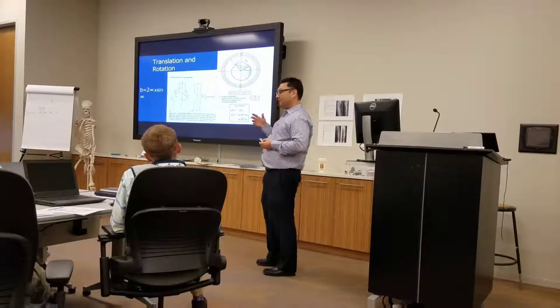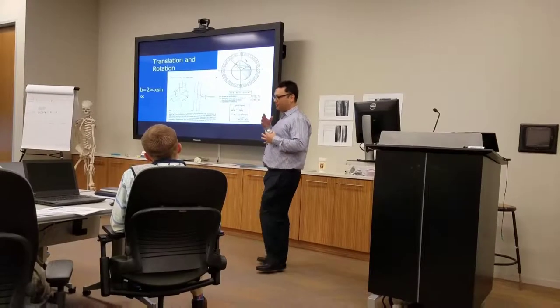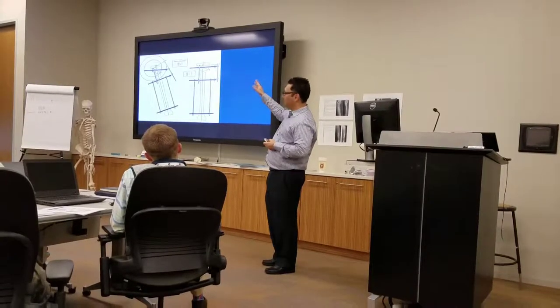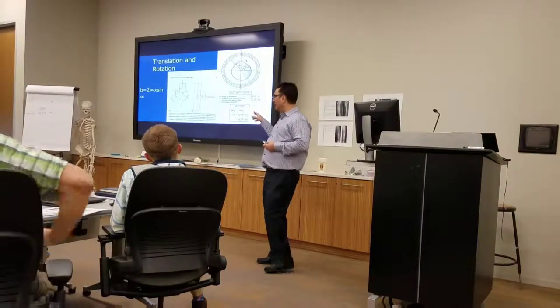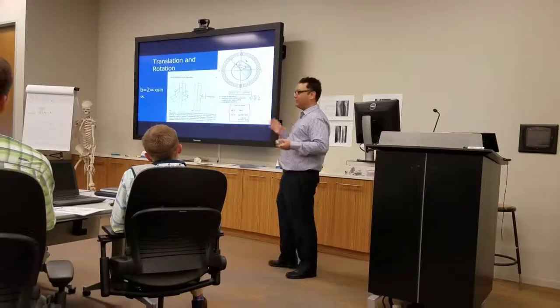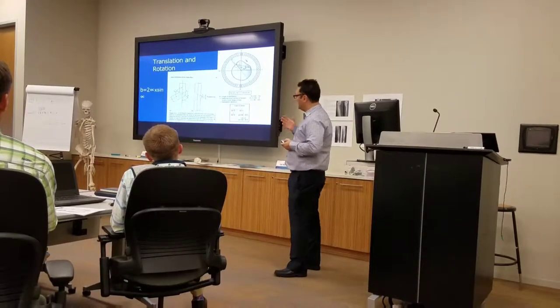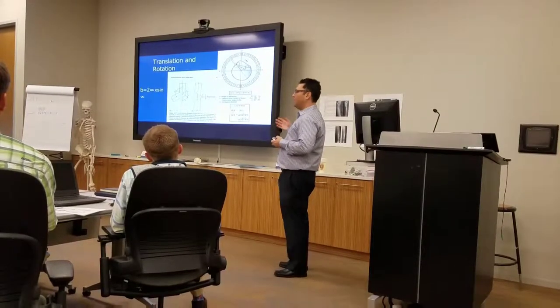Then, if you turn the pages in Paley's book again, this is really more for long bones, but it does affect the foot a lot. It's not just one angle. These formulas are really for just a one-plane deformity. Once you start adding rotation to the mix and you're looking at words like sine and cosine, your eyes start to glaze over. That's where it gets very complicated, making sure you're doing what's safe for the patient.